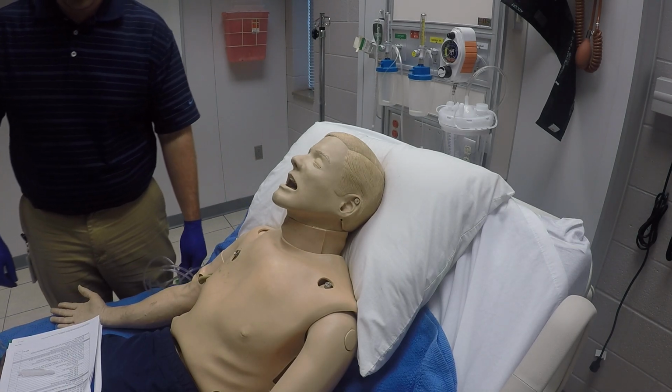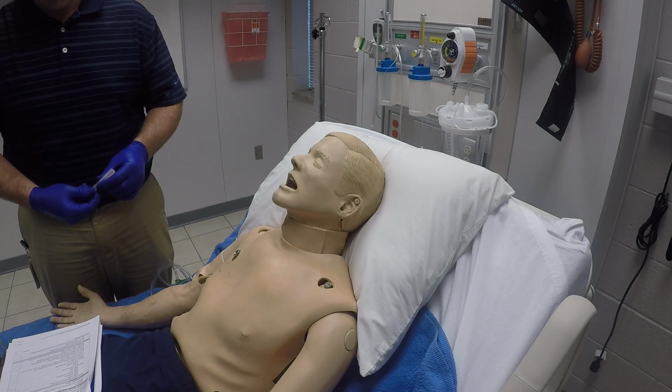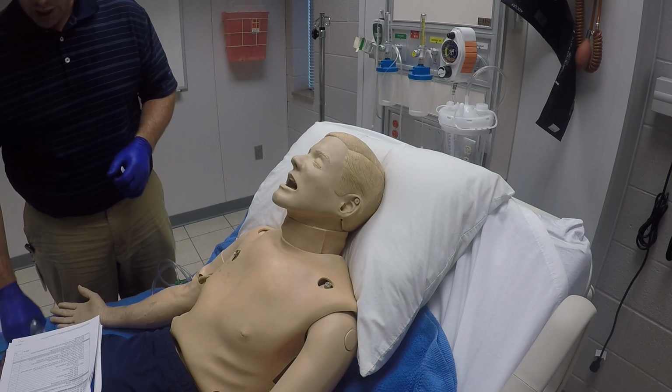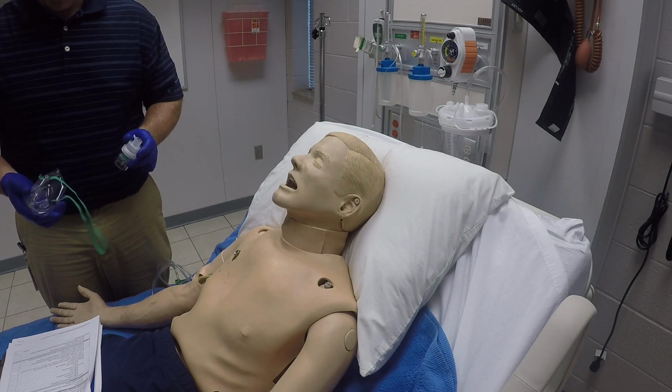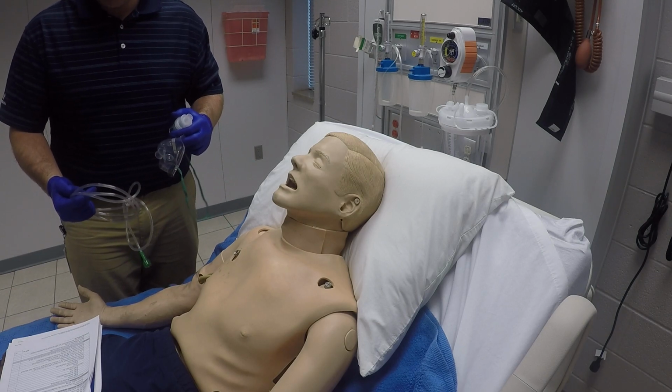This is inhaled medication administration. First thing, we're going to make sure we have all of our equipment that we need. We do have a medication here that we're going to be giving inhaled. Have a nebulizer unit here and a face mask, and then we also have some oxygen tubing.